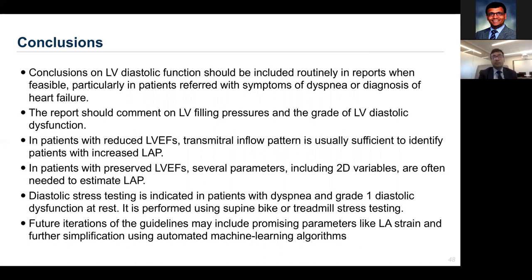Diastolic stress test is emphasized in the guidelines, particularly for patients who are continuing to have dyspnea of unknown origin and where you do not know whether it's coming from the myocardium. And if you cannot get the answer on exercise echo stress testing, you may also need to look into exercise cardiac catheterization to get the answer.